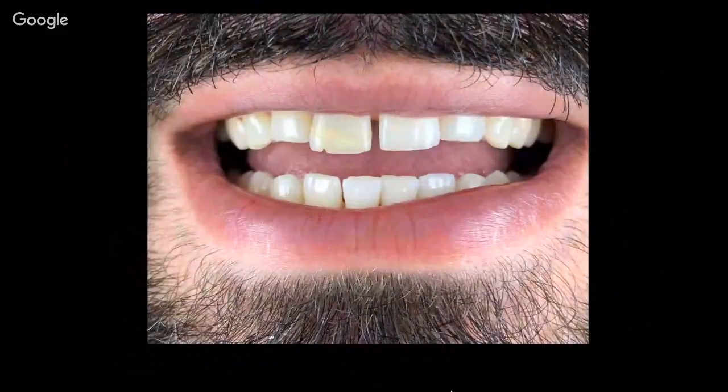Another case: a 30-year-old male patient came to our practice with a diastema, a gap between the centrals, discoloration on tooth number 11, and slightly broken teeth. So what parameters are we going to give our lab here to do the wax-up? Here, we decided to keep the central at the same length, because at rest position and smile position we can easily see this tooth. A full set of photos was taken.